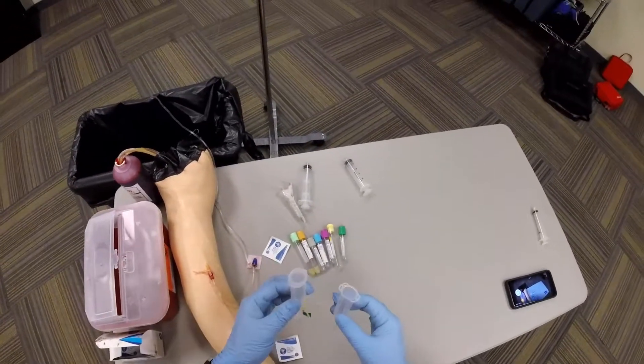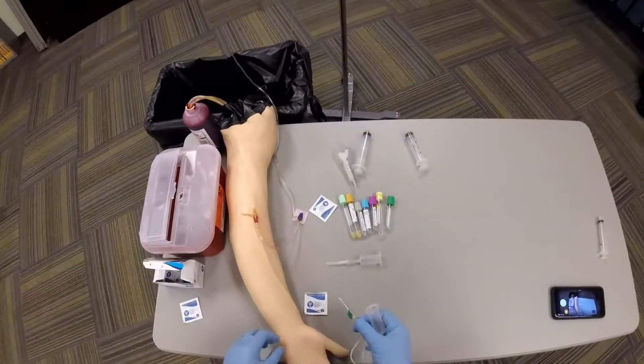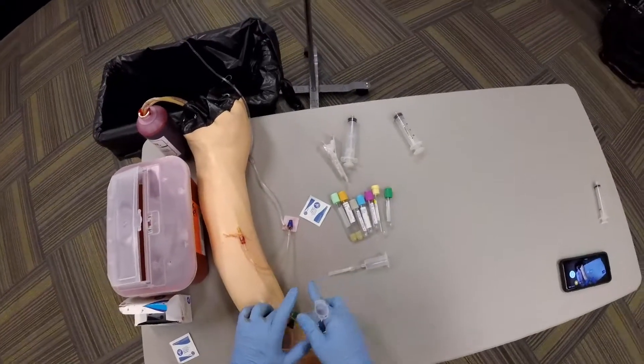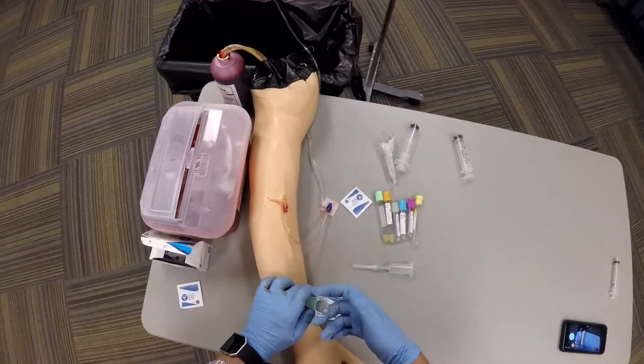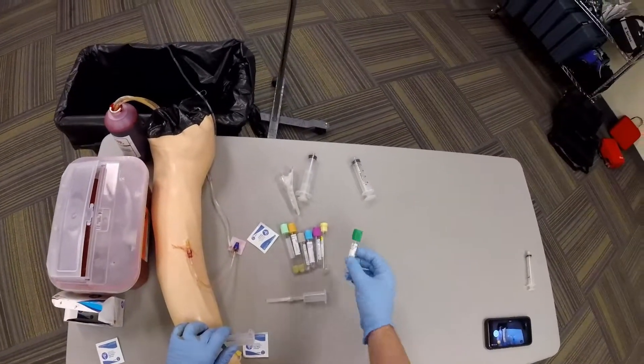You can use a vacutainer attached to a needle if you do not have an IV. Follow normal IV precautions, get blood flow to return, and you can insert the test tube into the vacutainer and fill to the prescribed amount.